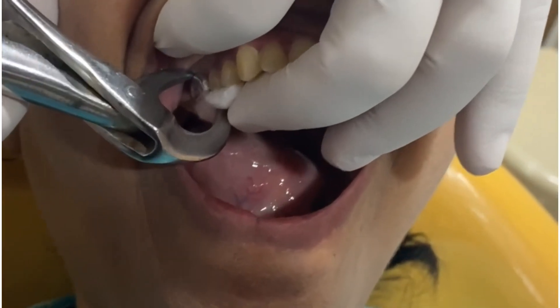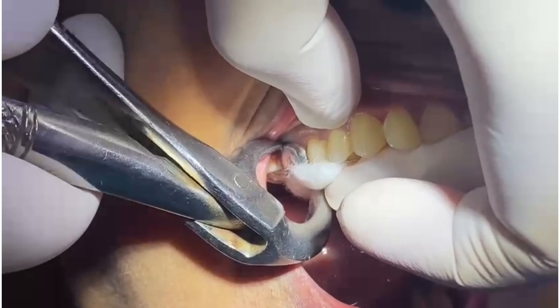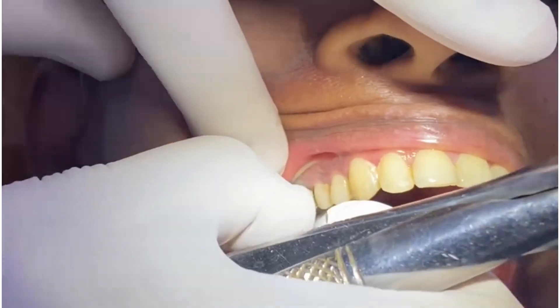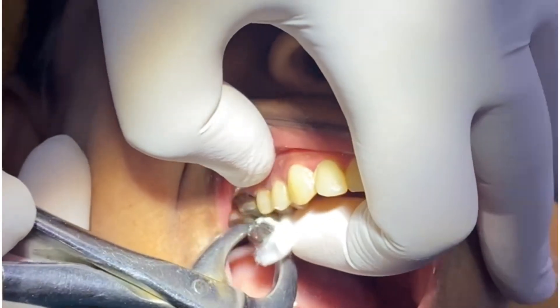So this procedure works mostly in 90% of the cases, and very easily you can get the crown removed without using the pressure of a crown remover and without cutting it. Hold the cowhorn forcep in the reverse direction with support of cotton on the occlusal surface. So like in this case, if you are doing the maxillary crown, hold the cowhorn in reverse and try to pull it down.